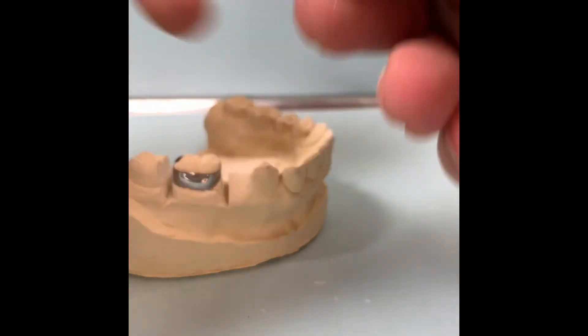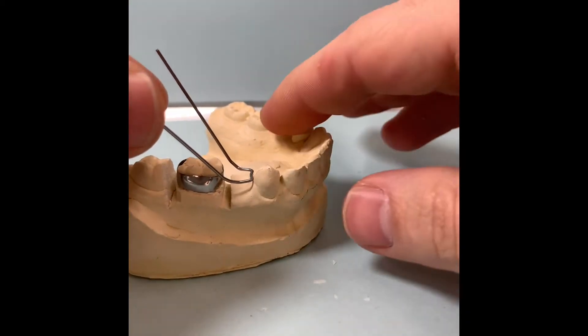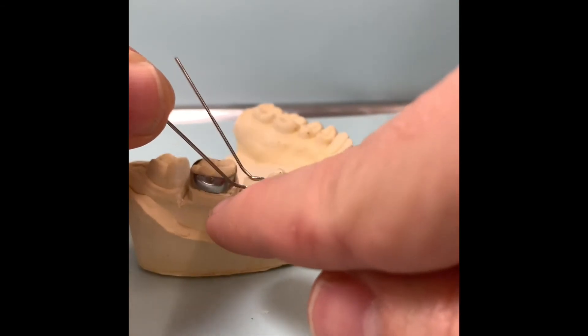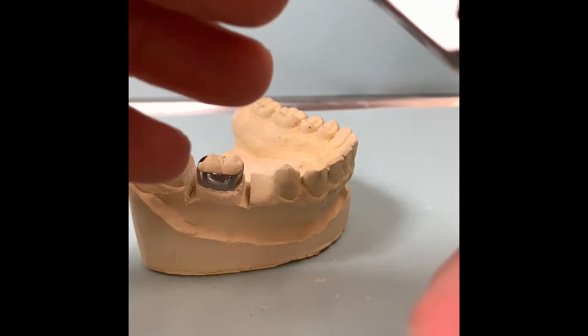Now you have a loop that's not going to interfere and it's not going to hold any food trap. And then when we place it on, it has a little loop, and our goal is right where it's touching the teeth to make a 90-degree bend in the middle of the band back.